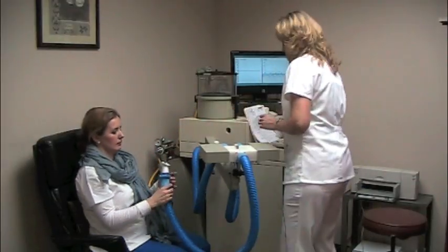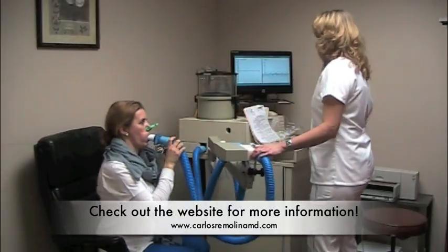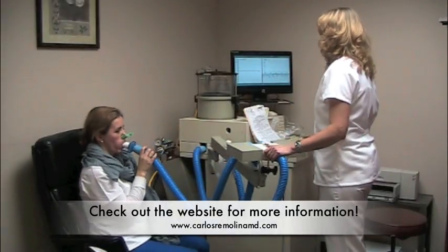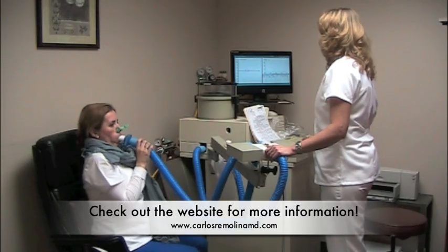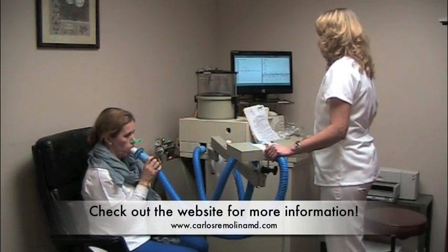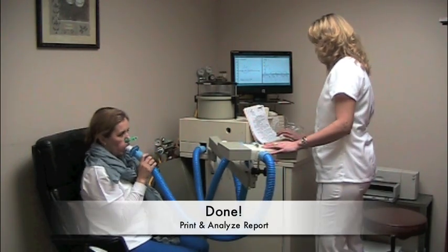Please put it into your mouth and we're going to repeat the test. Just please breathe normal. Take a deep breath in and blow it out. Take a deep breath in. Good. Thank you.